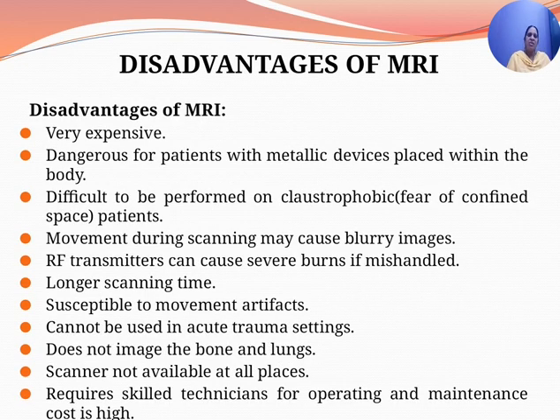Some of the disadvantages of MRI scanning are that it is very expensive. This method is an expensive method. It is dangerous for patients with metallic devices placed within the body, like a cardiac pacemaker or any metallic clips from brain surgeries.